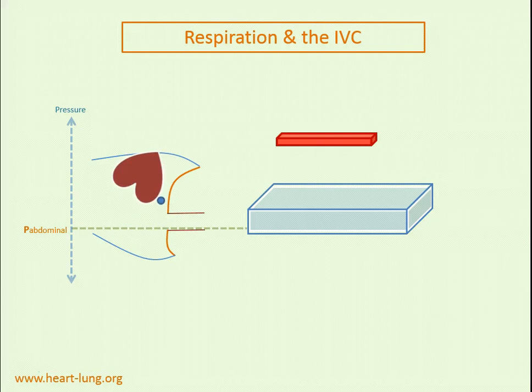So the right atrial pressure may fall below intra-abdominal pressure and then rise above intra-abdominal pressure. You may see IVC collapse, but it's hard to standardize this because patients will have varying effort, varying lung and chest wall compliances, varying degrees of PEEP applied. So that will complicate things. Let's go back to our baseline.